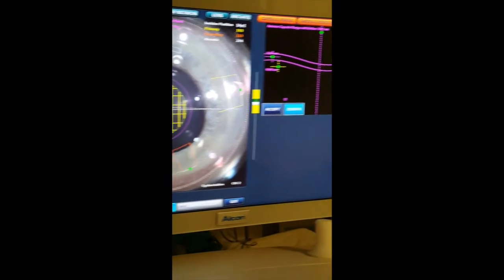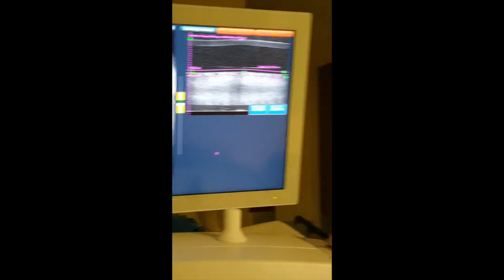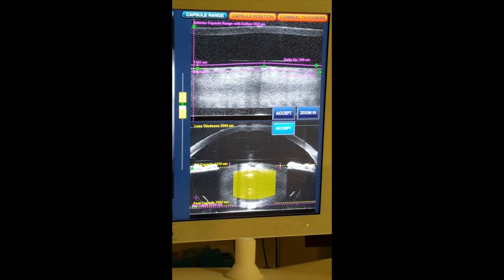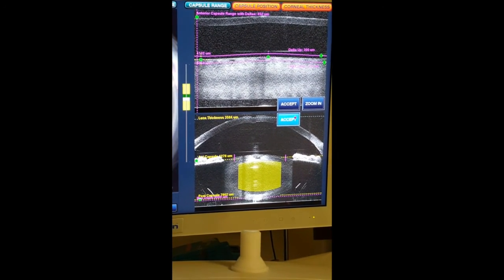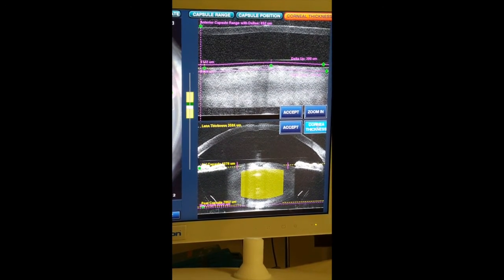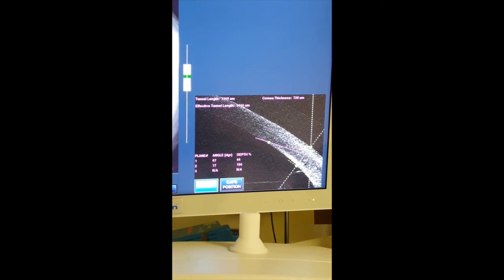Here's an additional surgery from the same day. Again, I'm just showing these for repetition here. Again, I adjusted this incision a couple of times to get it in a good position so that the center of the cornea is white. Here's the first image, shows that there's a little bit of clear cornea in the middle there.